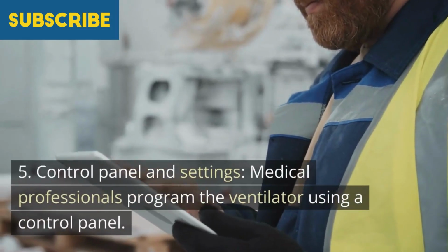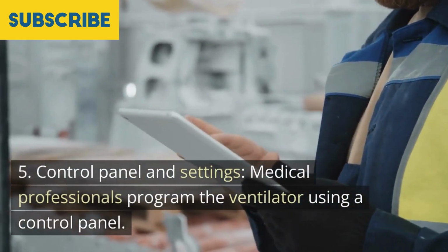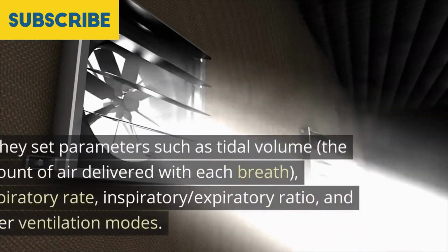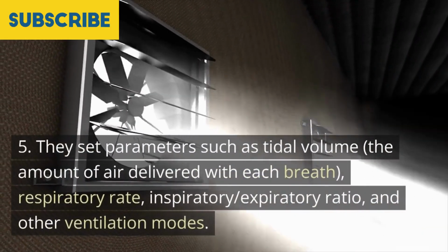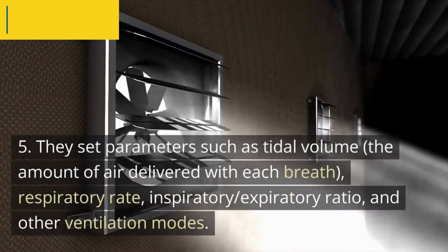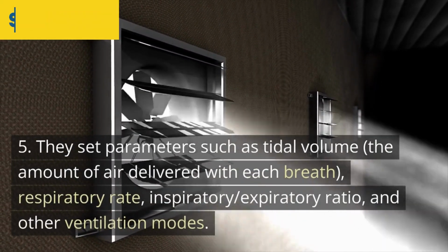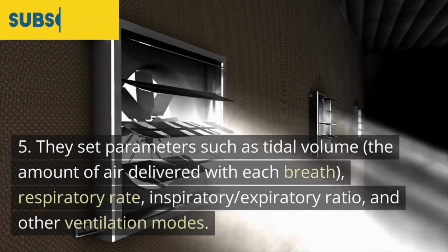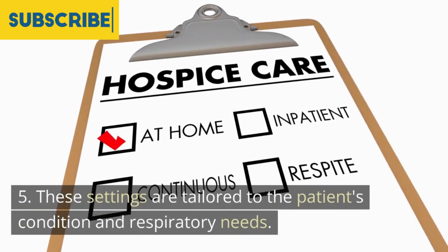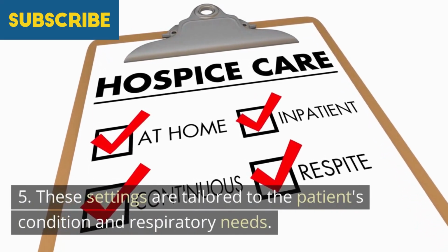5. Control panel and settings. Medical professionals program the ventilator using a control panel. They set parameters such as tidal volume, the amount of air delivered with each breath, respiratory rate, inspiratory-expiratory ratio, and other ventilation modes. These settings are tailored to the patient's condition and respiratory needs.